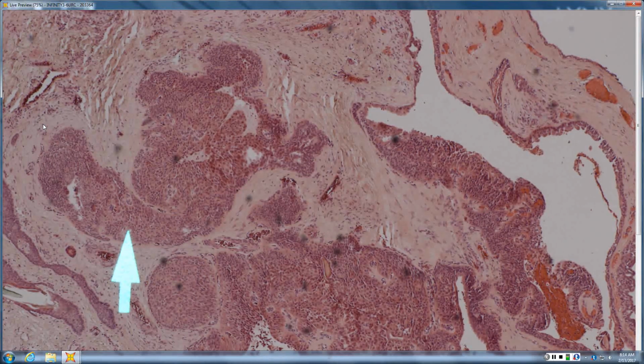So acrospiroma group is pink with ducts and does not palisade. Blue with ducts. Anybody? Sebaceous. So blue with ducts, especially blue with circular red ducts, is sebaceous. Pink with ducts is acrospiroma.